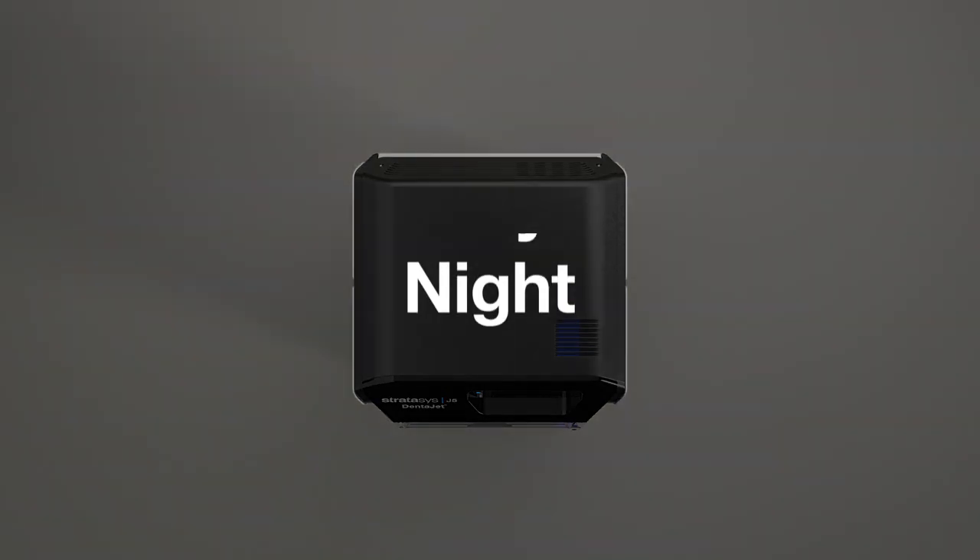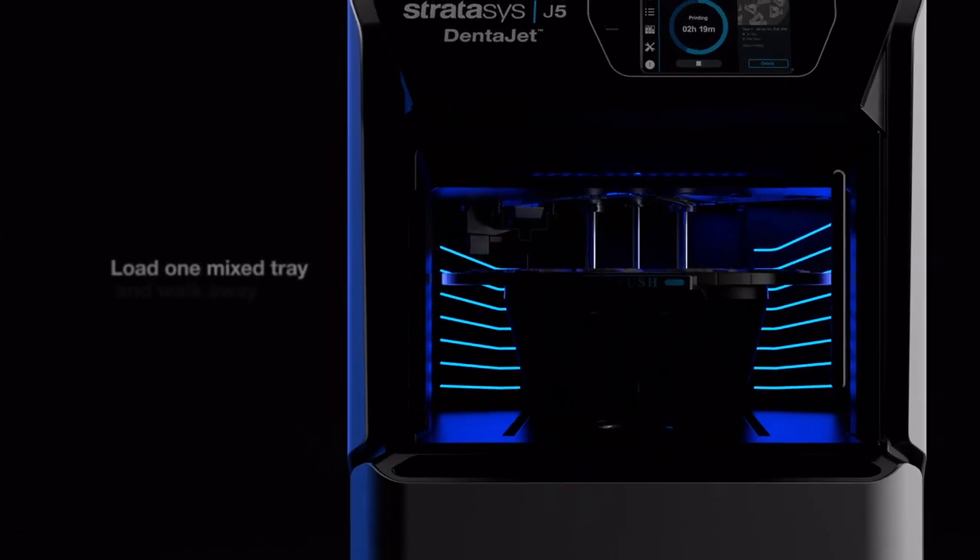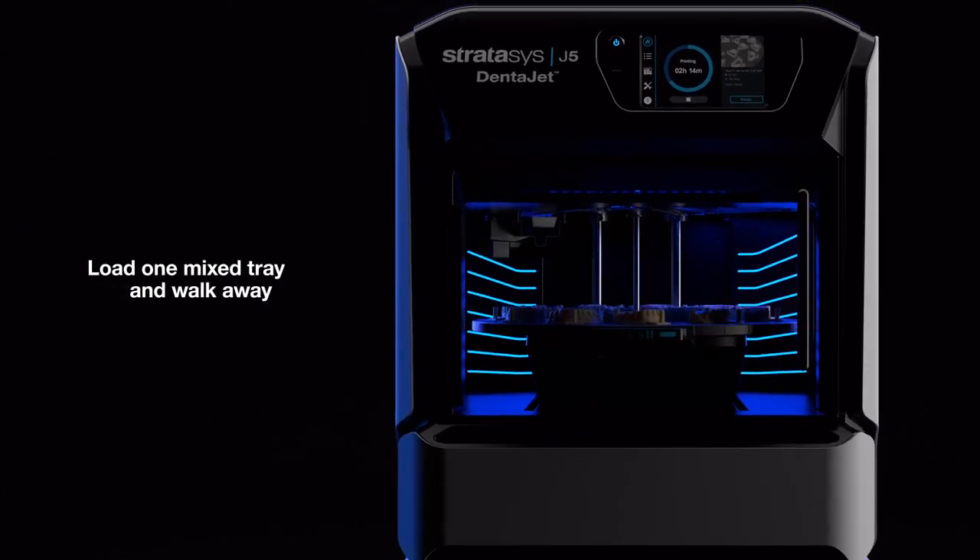Print day or night in high volumes with confidence. Simply load one tray and walk away. The DentaJet is like having three printers in one.